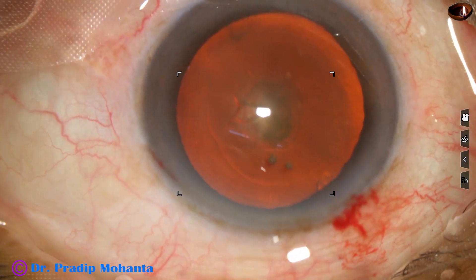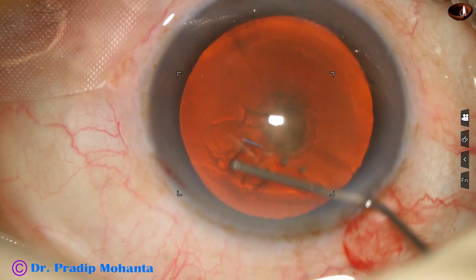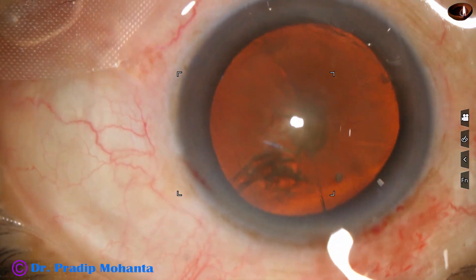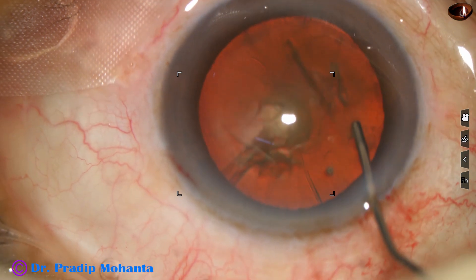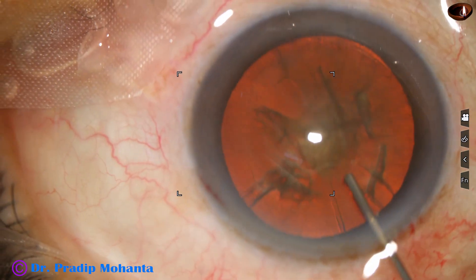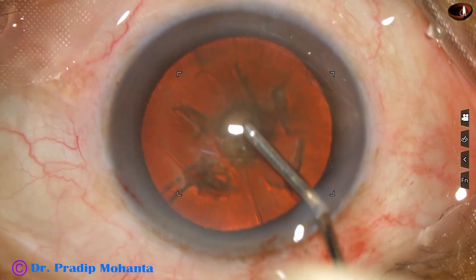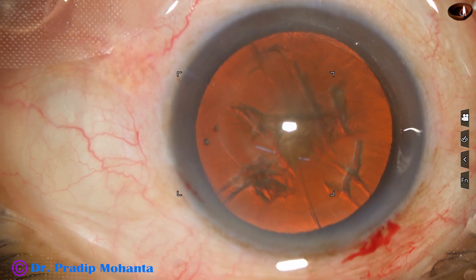Now, hydrodissection. I am cautious about doing hydrodissection because there is opacity right at the center of the posterior capsule, in the sub-capsular area. So I did not rotate the nucleus mass — I did gentle hydrodissection, and now I fill up the anterior chamber again with 2% hydroxypropylmethylcellulose.